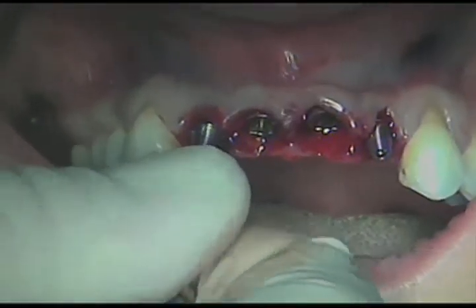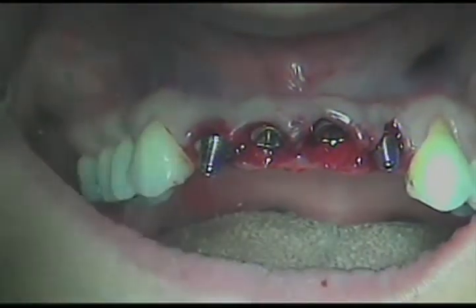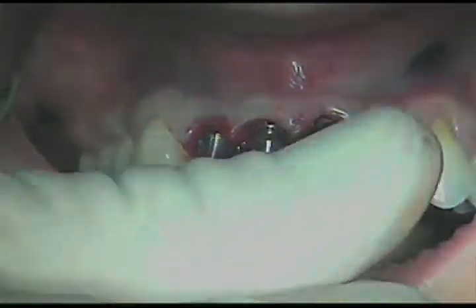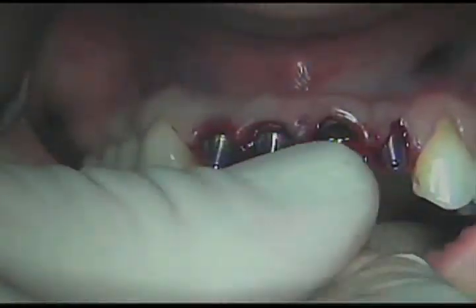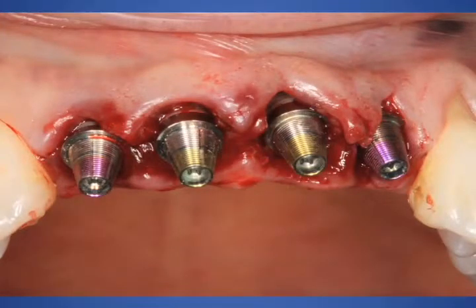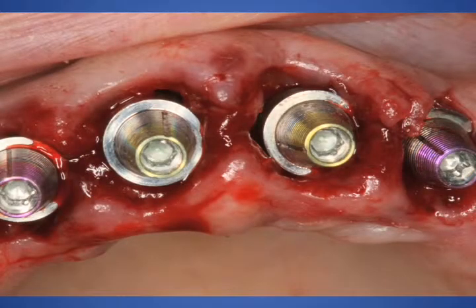We're going to place the transitional abutments in position. They're conically shaped, so it allows us a little bit of flexibility for the transitional splinted crowns. Close-up view, and you can see there are no sutures here, and this is immediately upon implant placement and seating of those transitional abutments.